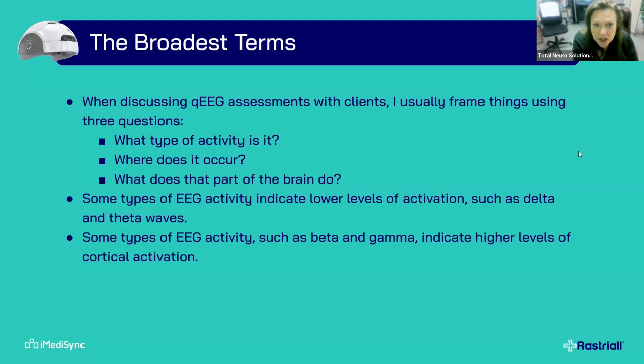And that's the beauty of EEG work. And so, being able to compile that information and come back to your client and say, hey, there is a functional, measurable reason why your memory is not so good, and your verbal fluency and word finding is not as fast as it used to be. You're dropping your words. That's because this area processes that, right? And you have a slow wave there or a dysfunction there.